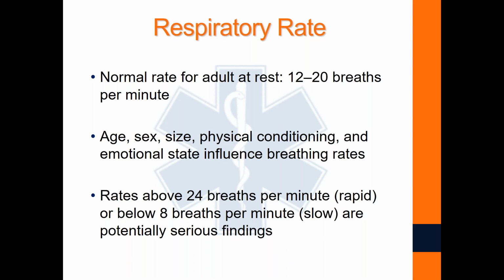So that right there is the definition of failure. And we're going to ventilate that person as well. 1 breath every 6 seconds with the BVM attached to 100% oxygen.